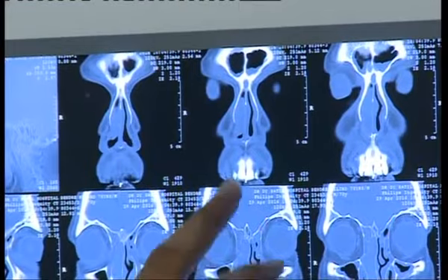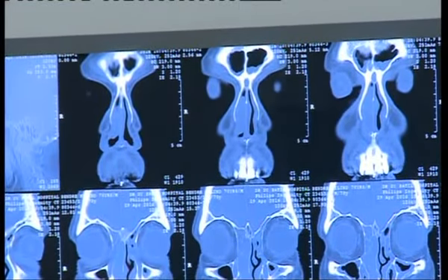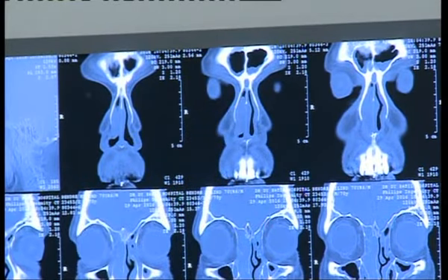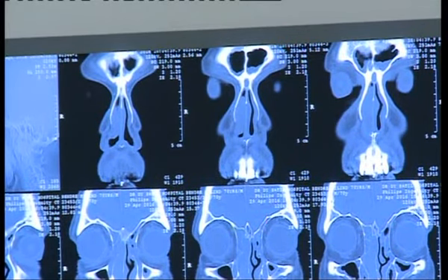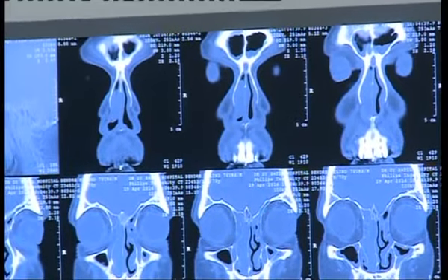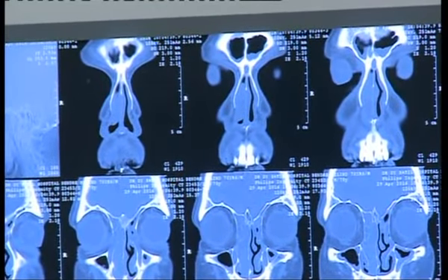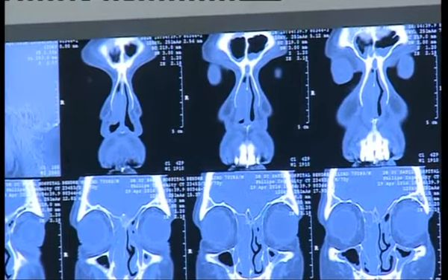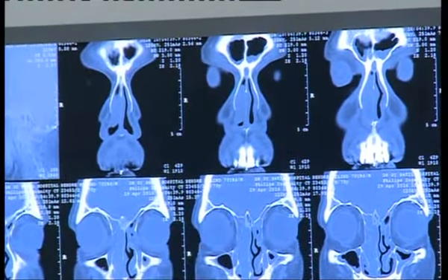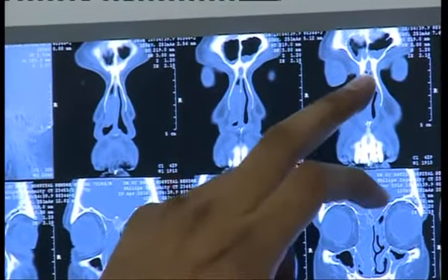Okay, Satish, sorry to interrupt you. That interfrontal cell that you're talking about, is it clinically or surgically relevant to this very case? Yes, very important. See, this is pneumatization which occupies the frontal recess ultimately. The outflow of this is the frontal recess, and it is draining into the frontal sinus. So sometimes when it is big, it can push the frontal outflow a little lateral, and it can make your situation difficult. So you need to know if there is a frontal sinus cell.